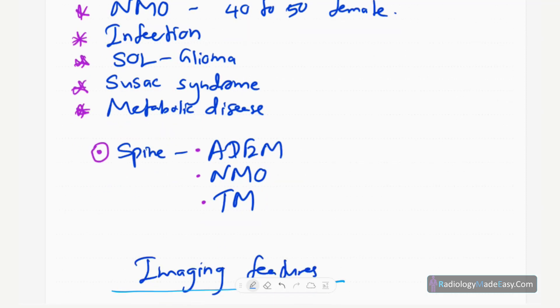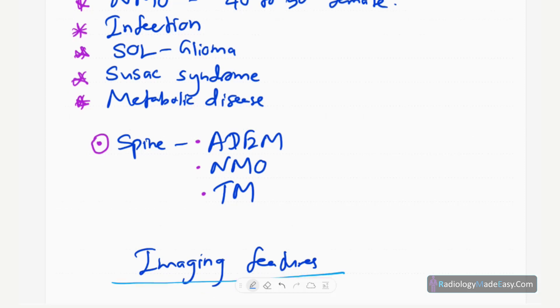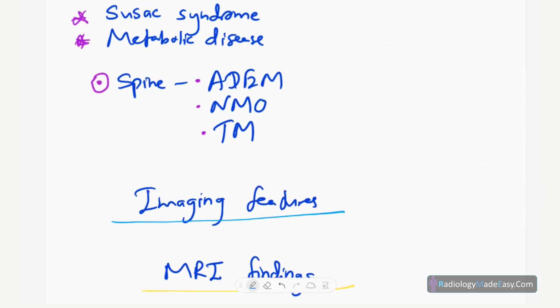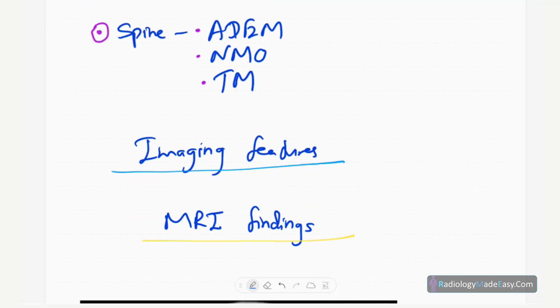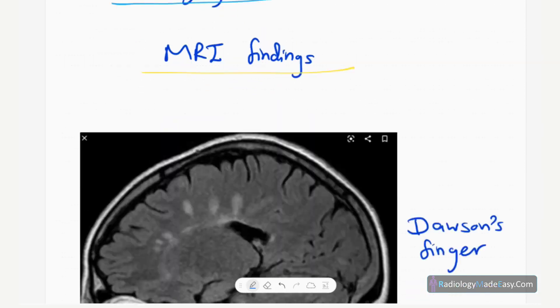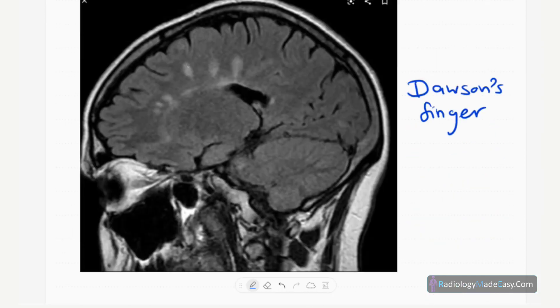In the spine, differential diagnoses include ADEM, NMO, transverse myelitis, and infections. Our main aim is to describe the imaging features of multiple sclerosis. The most important imaging modality is MRI.